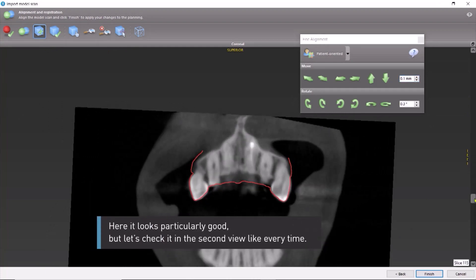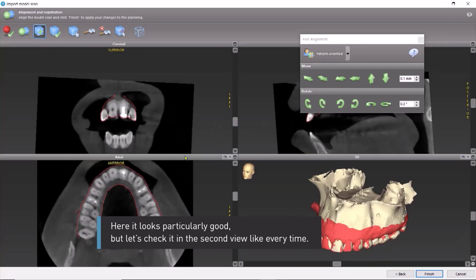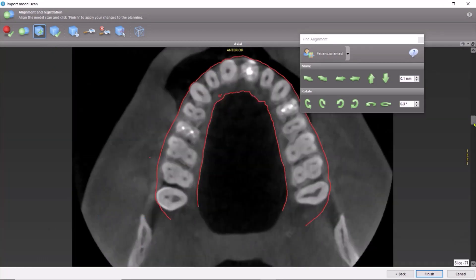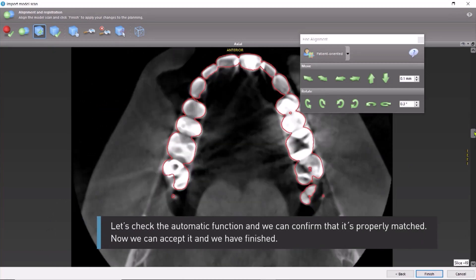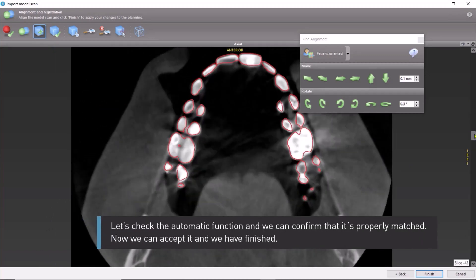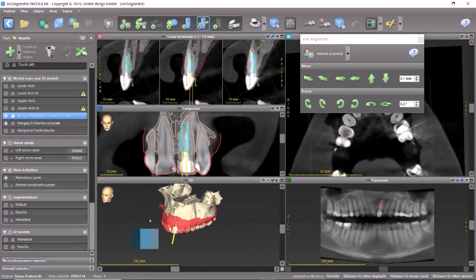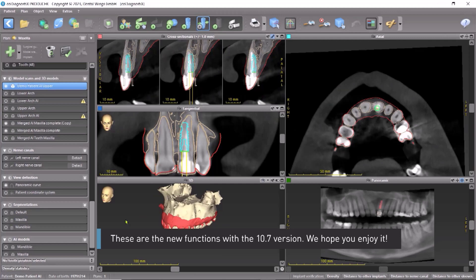It looks particularly good, but let's check it in the second view, like every time. Let's check the automatic function, and we can confirm that it's properly matched. Now we can accept it, and we have finished. These are the new functions with the 10.7 version. We hope you enjoy it.